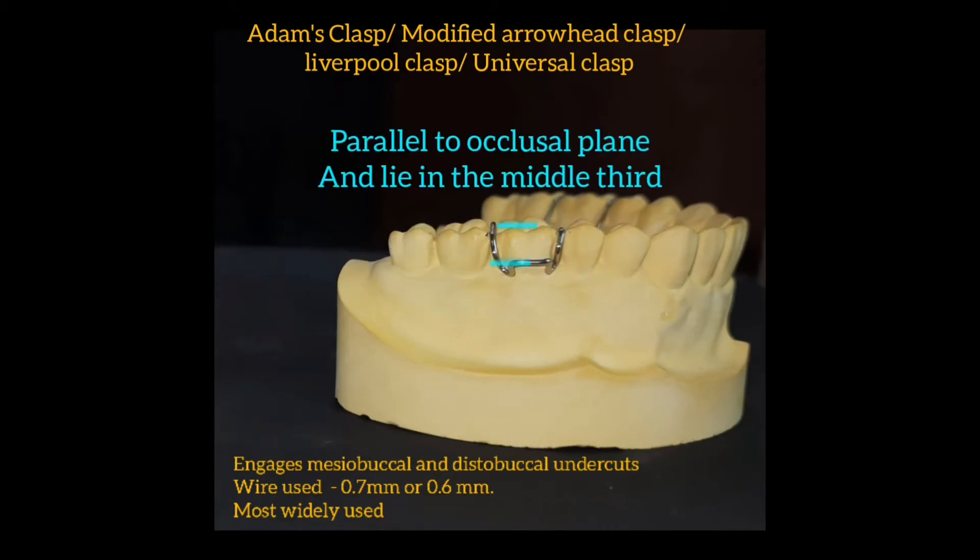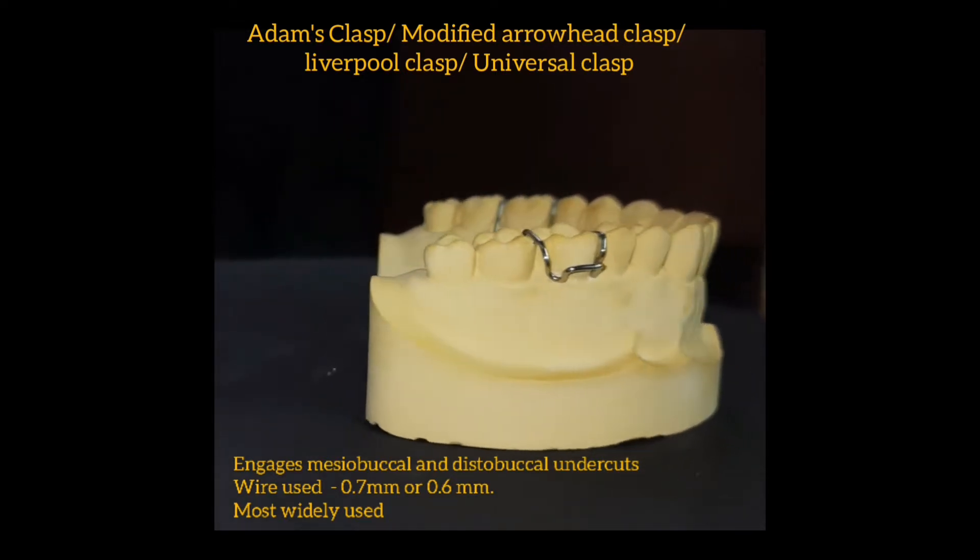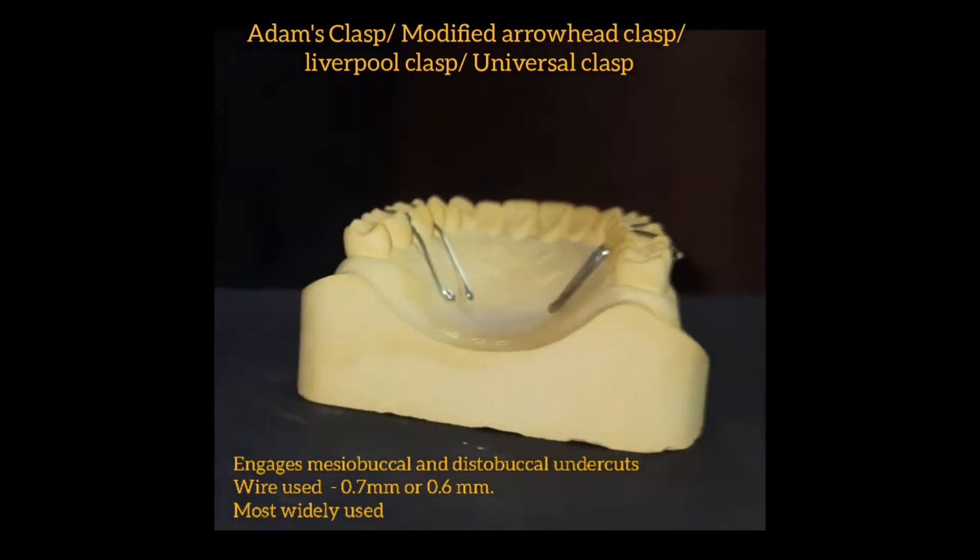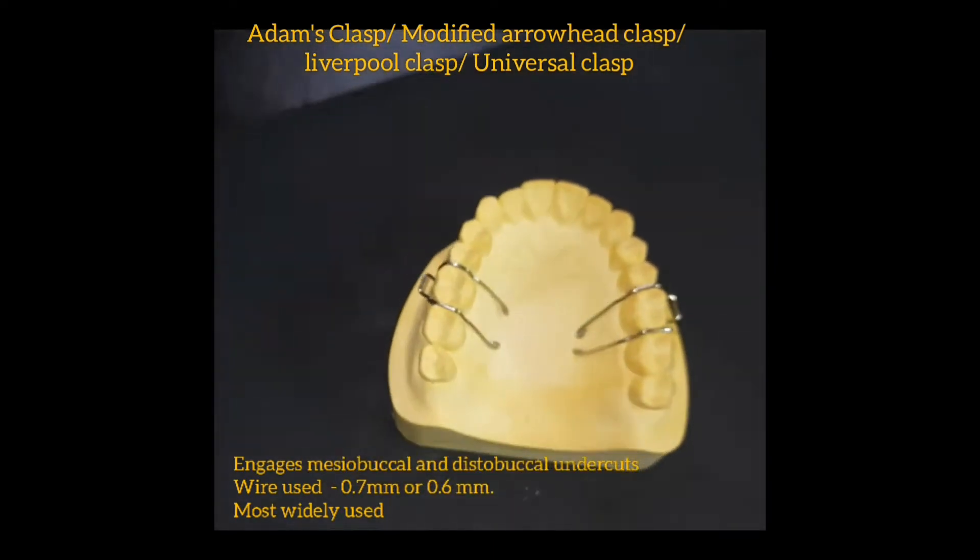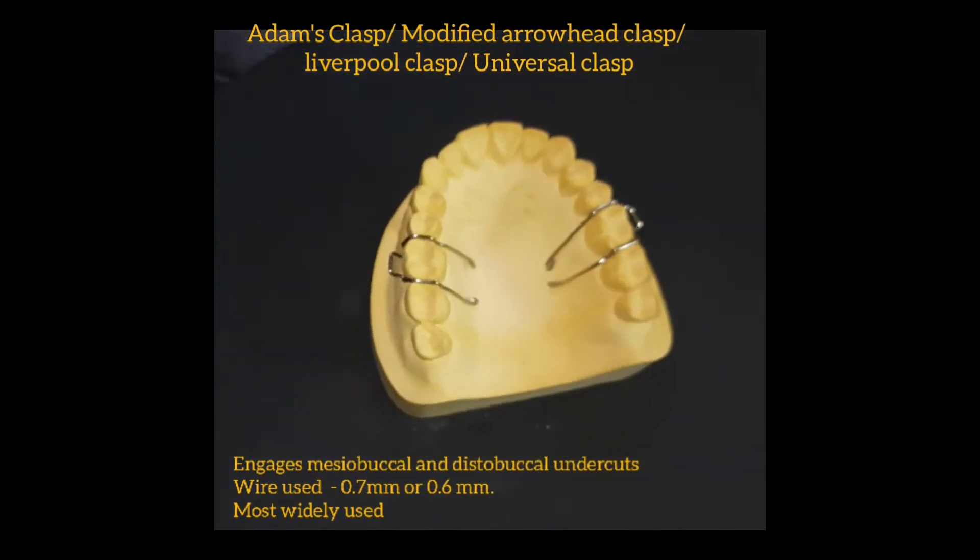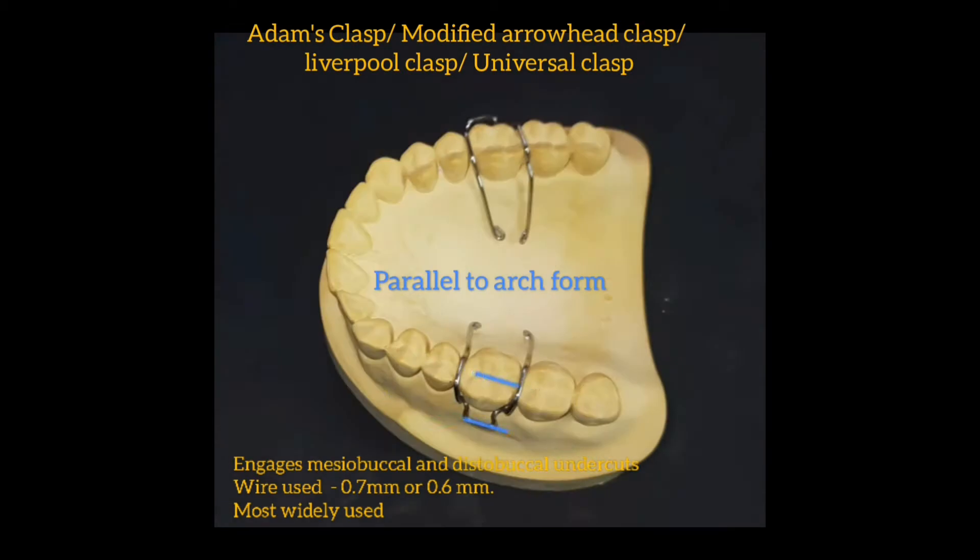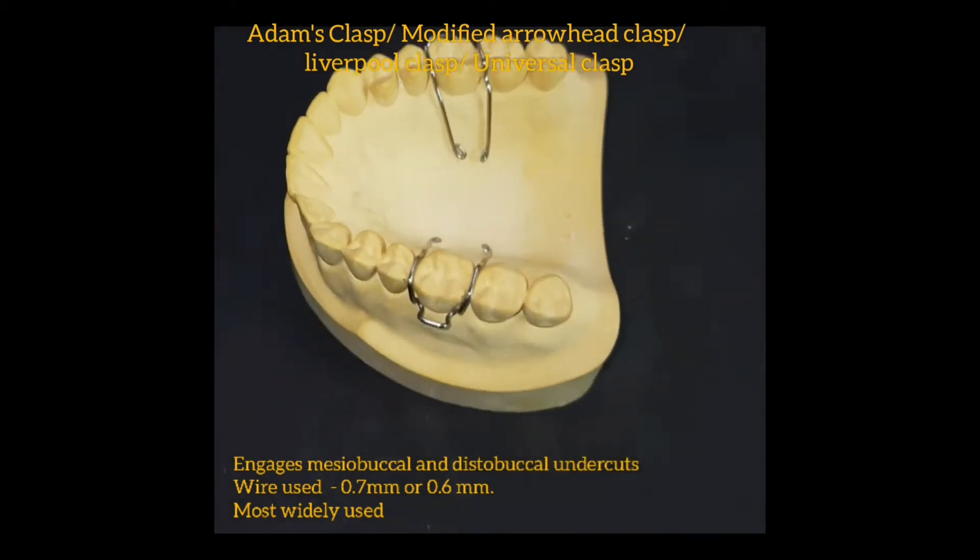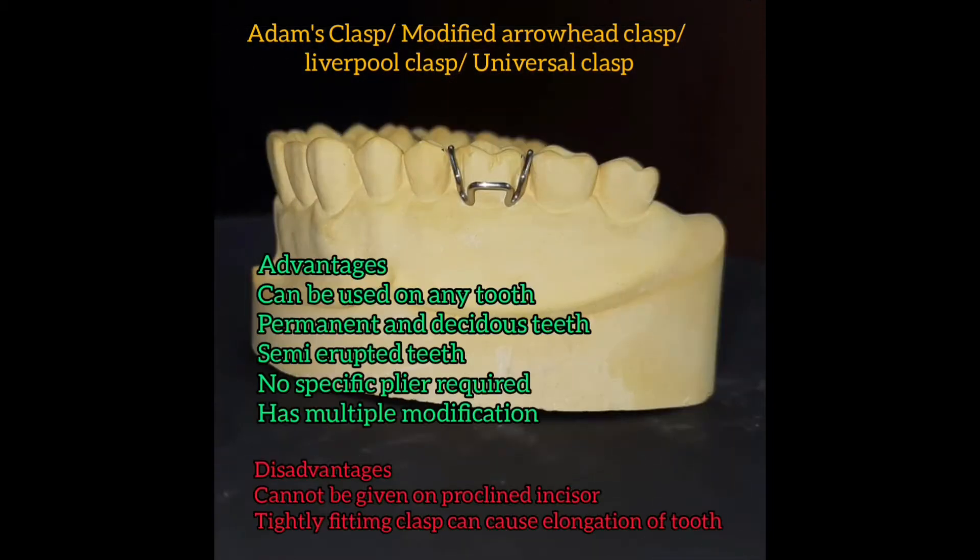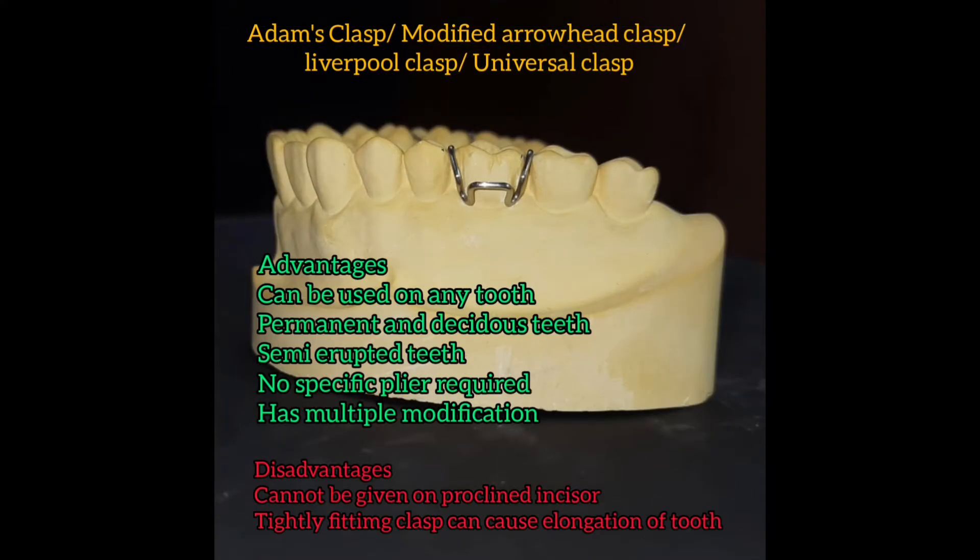The bridge is parallel to the occlusal plane and lies in the middle of the middle third. When we see occlusally both the mesial and the distal wire pass over and end over the hard palate and the bridge is also parallel to the arch form. The advantage of Adam's clasp is that it has a wide variety of usage and it also has multiple modifications as well.